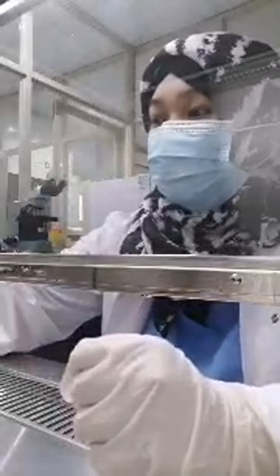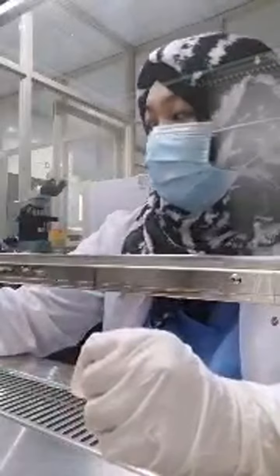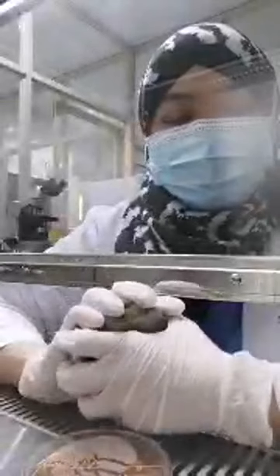Then, for the stool, when you receive the stool culture, for us here, we will put it onto the agar. The SSA agar, or the Salmonella Shigella agar, and the TCBS for the Vibrio cholerae.